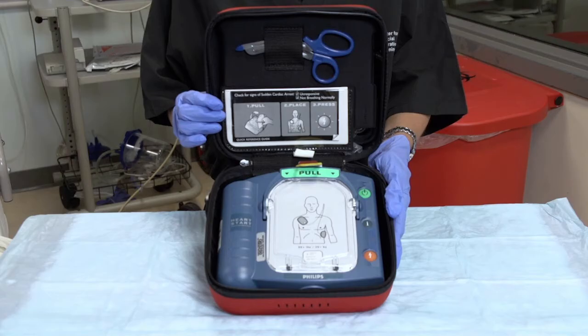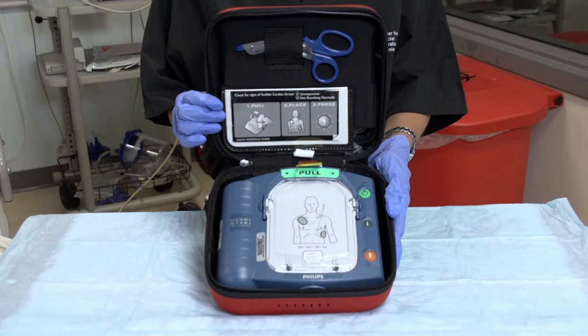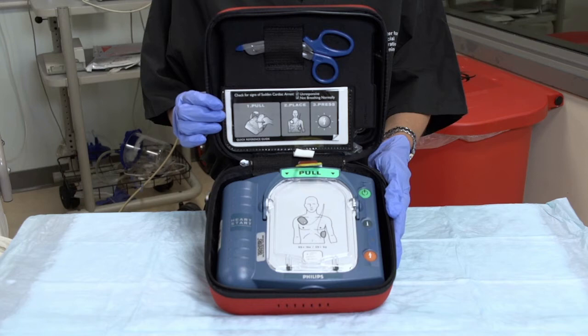With an AED, turn it on and follow the on-screen prompts. Be sure that no one is touching the patient when it is time to deliver a shock.